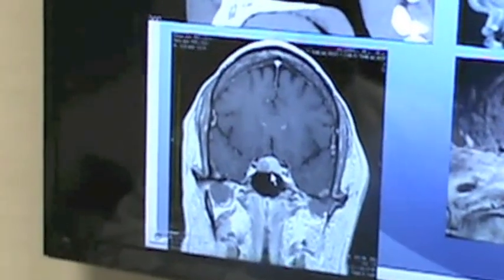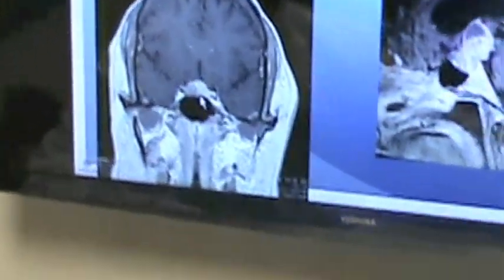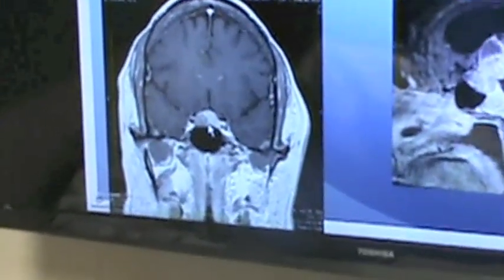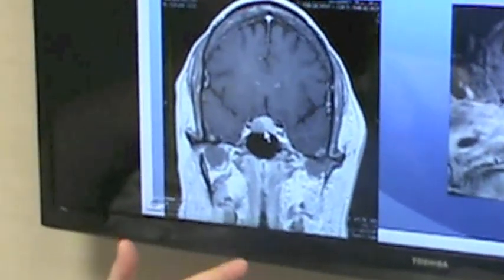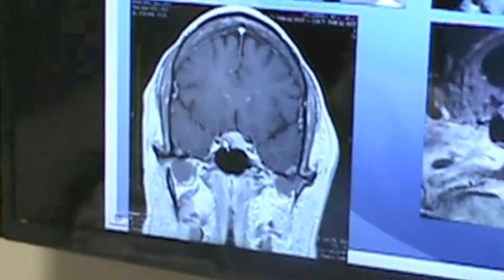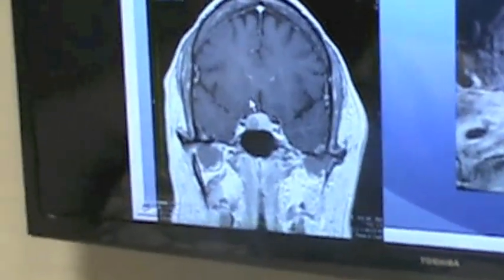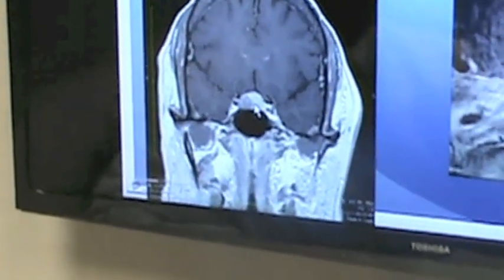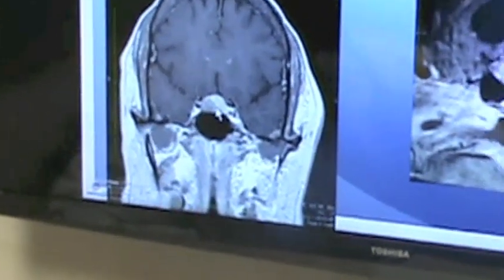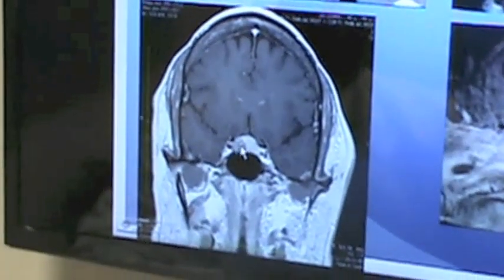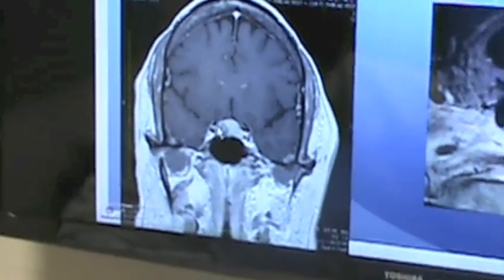This patient is a good example of a microadenoma where the patient has an ACTH tumor. They have the symptoms of Cushing's disease, but they have this small growth here. It's not pushing on the eyes, and it's not pushing on the artery, which is right there. So if this was a non-secreting tumor, we'd probably just watch the patient. But since this is a secreting tumor, it needs to be removed.